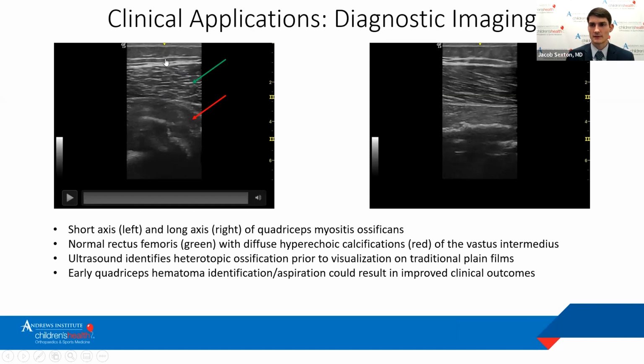This is the superficial soft tissue structures with the fascial plane turning into the muscle tissue here. So this is the rectus femoris. And as you can see, it has that nice starry sky pattern that we had earlier. You see the hyperechoic elements with mostly hypoechoic area. Then you have the fascial plane separating the vastus intermedius from the rectus femoris.